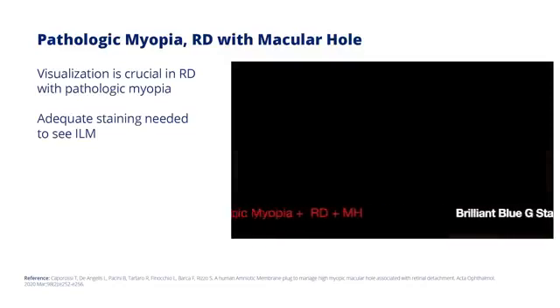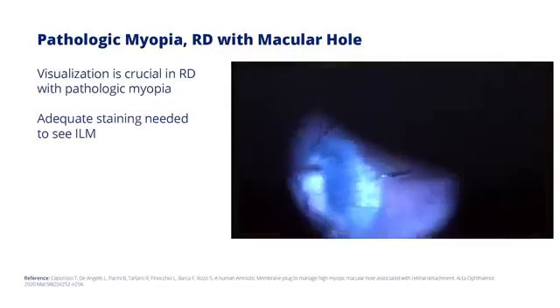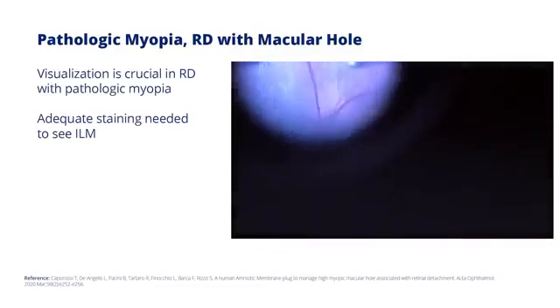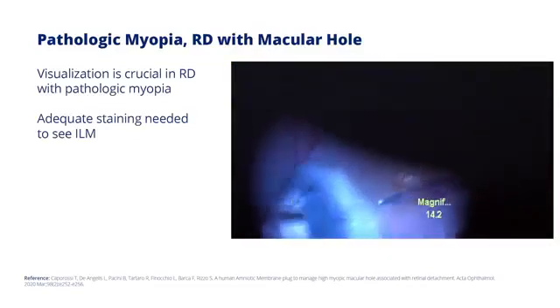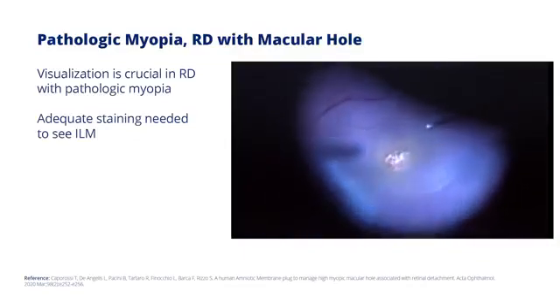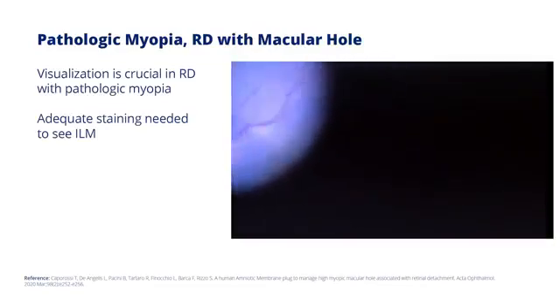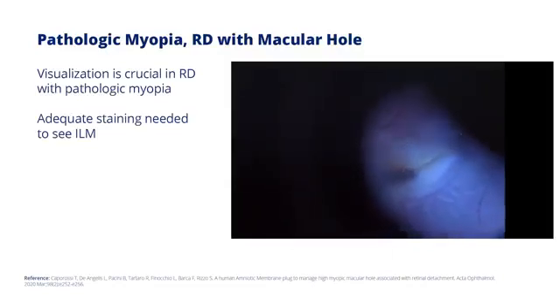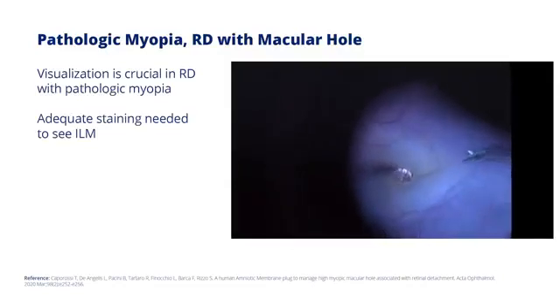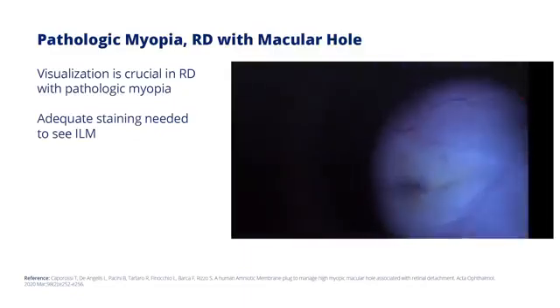So you can use either a pinch peel technique using retinal forceps, or you can use the finesse loop to scrape the surface of the ILM to create an edge. After which you can use end grasping forceps to peel off the inflexible ILM in an effort to loosen the retina and facilitate reattachment as well as macular hole closure. When the retina is very mobile, it may be necessary to stabilize the retina with liquid perfluorocarbon placed over the macular hole and posterior pole.